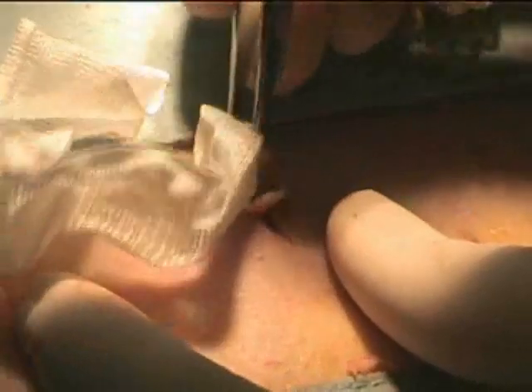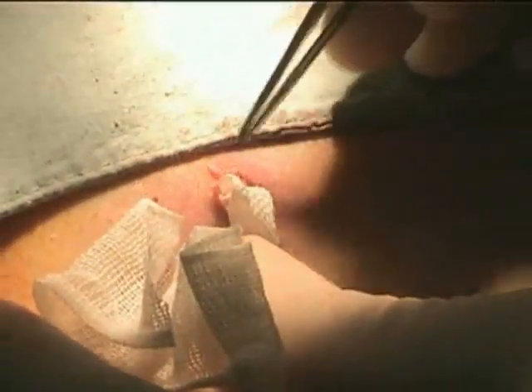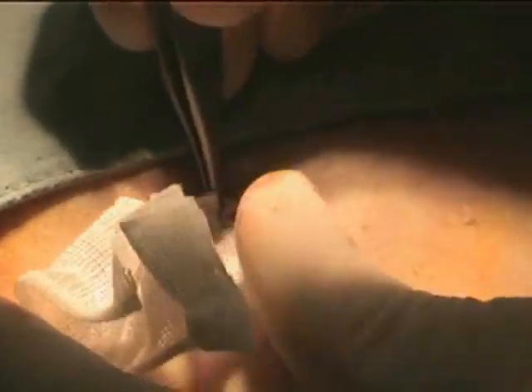Pack the cavity loosely with packing material, preferably iodoform gauze. The length and width used for the packing depends on the abscess size. After packing the wound, leave a small tail of gauze protruding from the wound to allow for drainage and eventual removal of the gauze. Do not pack the wound tightly, as this does not improve outcomes.